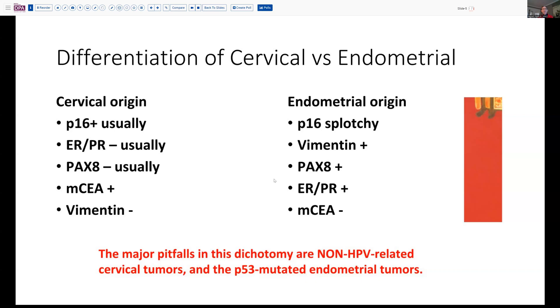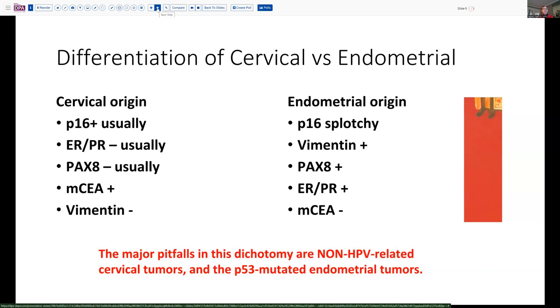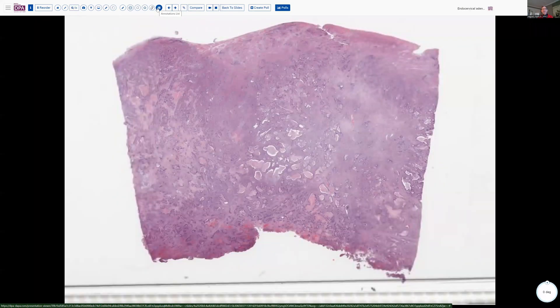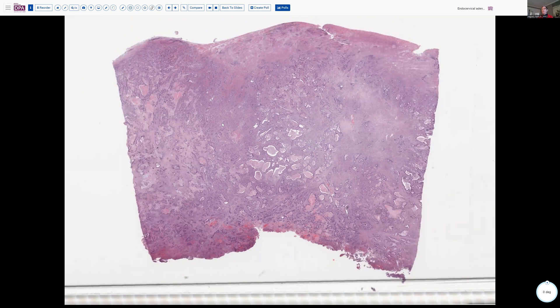The pitfall in this dichotomy are the non-HPV-related cervical tumors — the so-called gastric types and so forth — and P53-mutated endometrial tumors, which may well be P16 positive and may be hormone negative. Those create additional potential pitfalls to be aware of. The patient came to surgery based on the assumption that she had an endometrial tumor, and in fact she did have tumor invading the myometrium, but she also had tumor diffusely involving her entire cervix and endocervical canal, extending up into the endomyometrium.